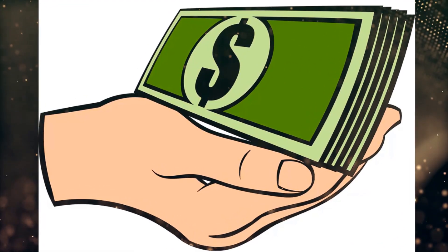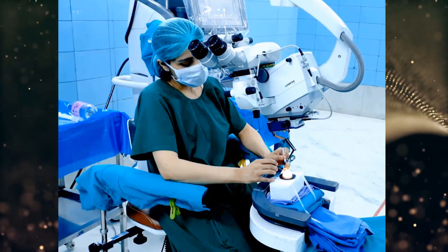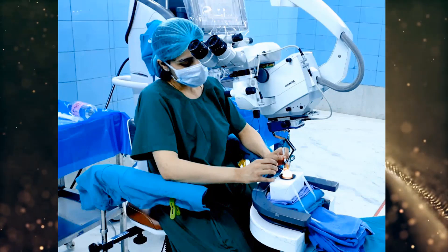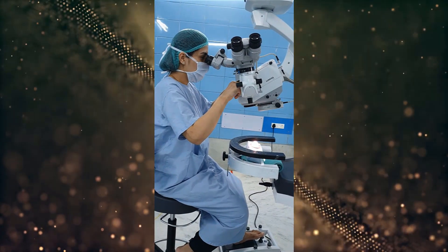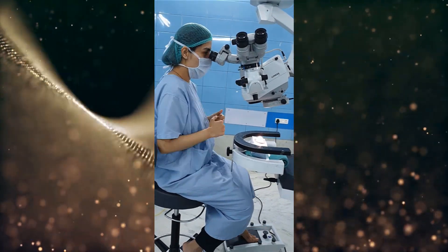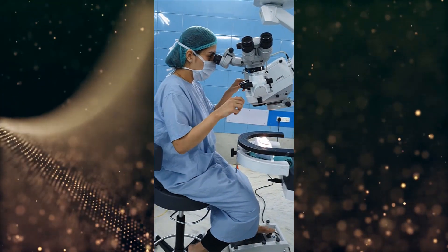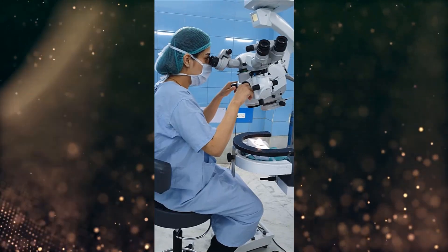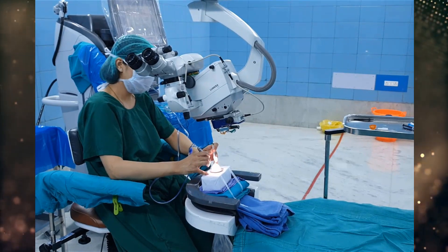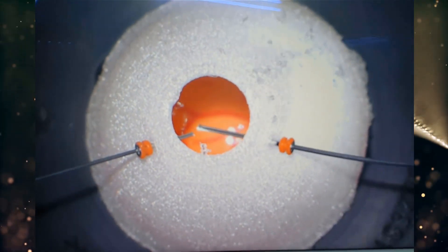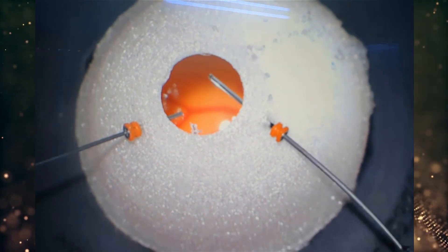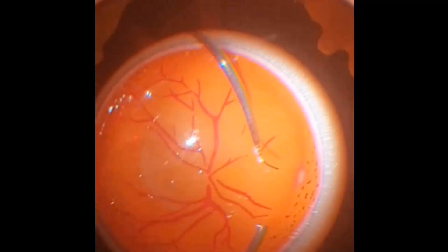It is cost-effective and can be practiced inside the operating room with available instruments. The practice of non-dominant hand maneuvers and flexibility can also be done using the eye model. The basic concept of core vitrectomy is vitreous removal without losing focus of microscope.